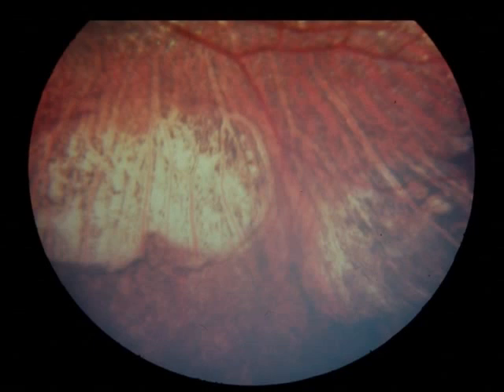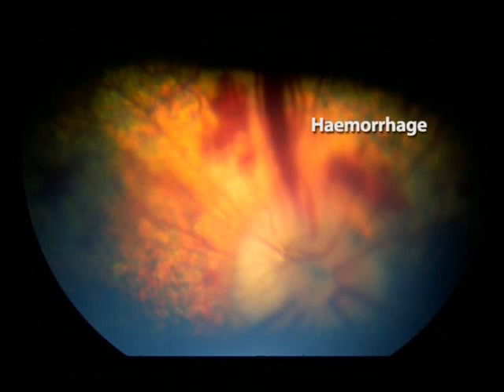Interpretation of abnormal ophthalmoscopic findings can be challenging, even to an experienced eye. The primary objective, therefore, is to identify when an abnormality is present, so that it can be interpreted in the context of other clinical findings.